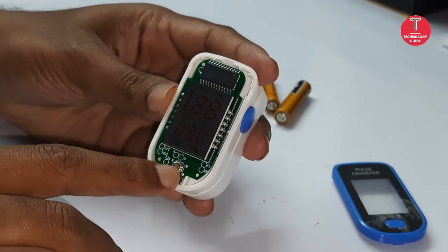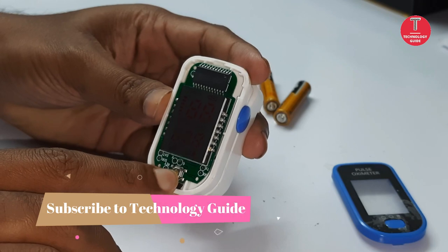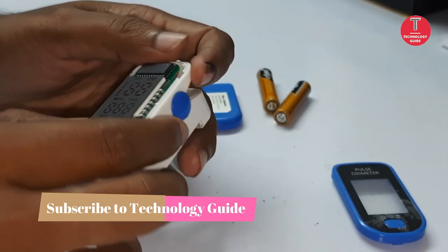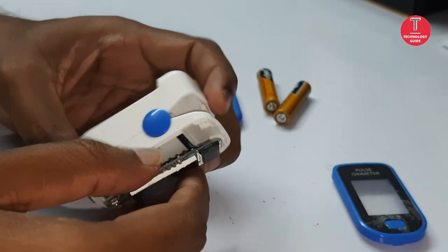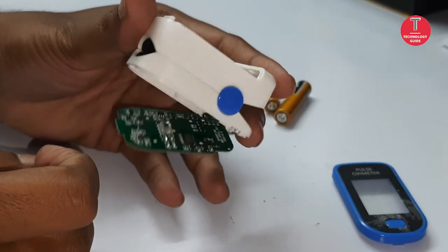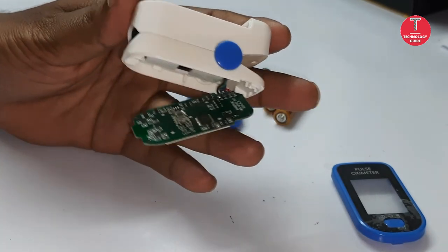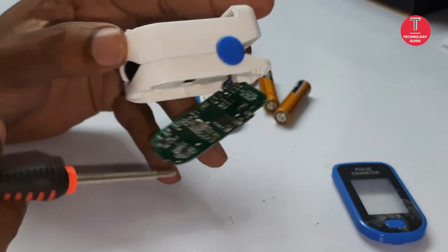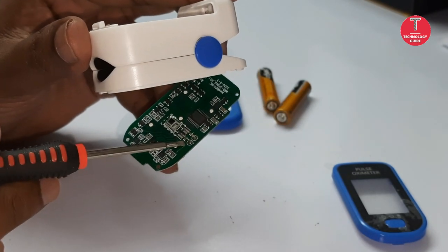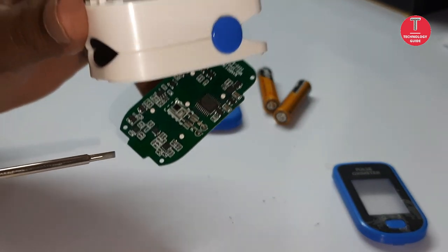This is a push button switch assembly type. Sensor module. This is a sensor module for detecting heart rate and oxygen levels.